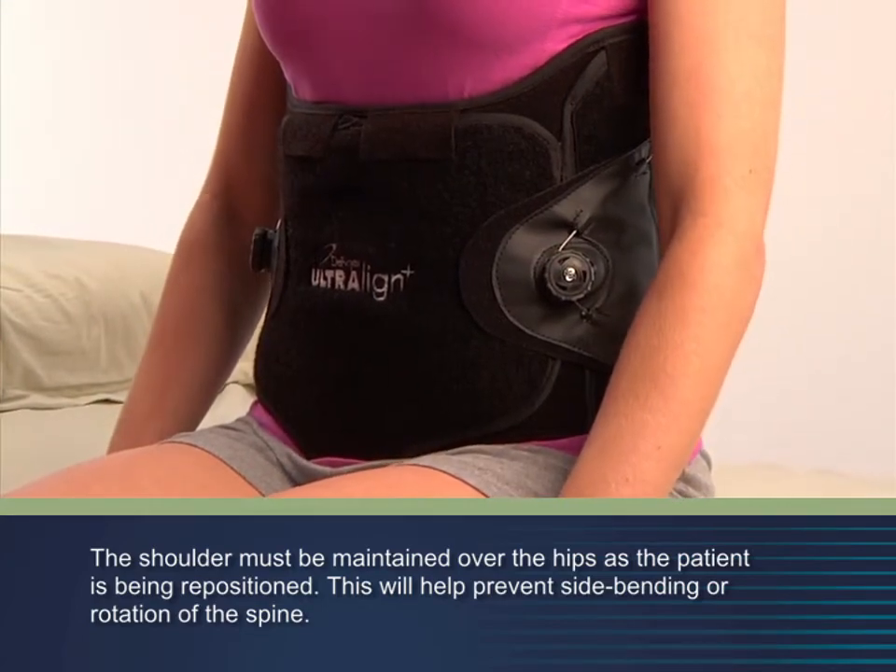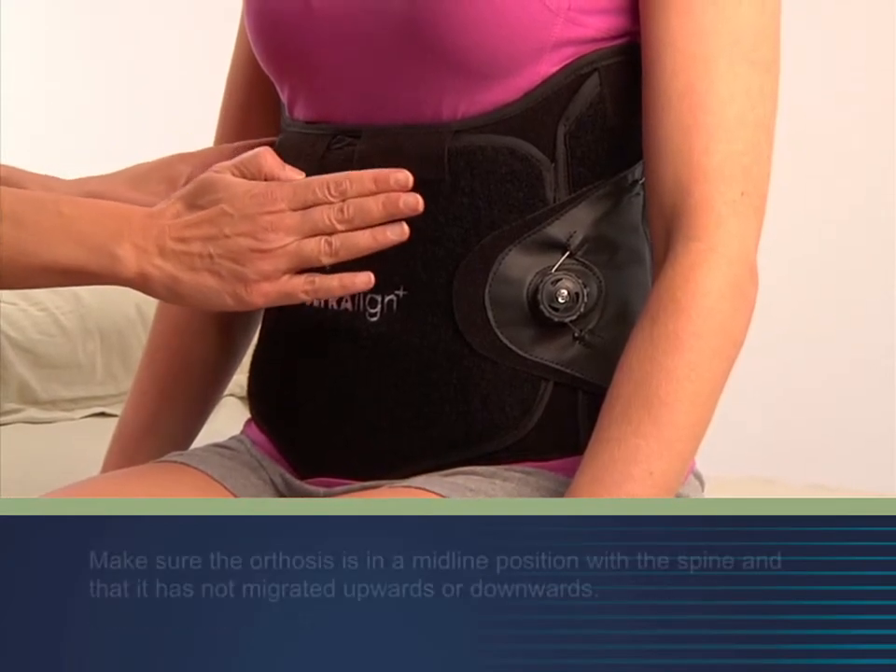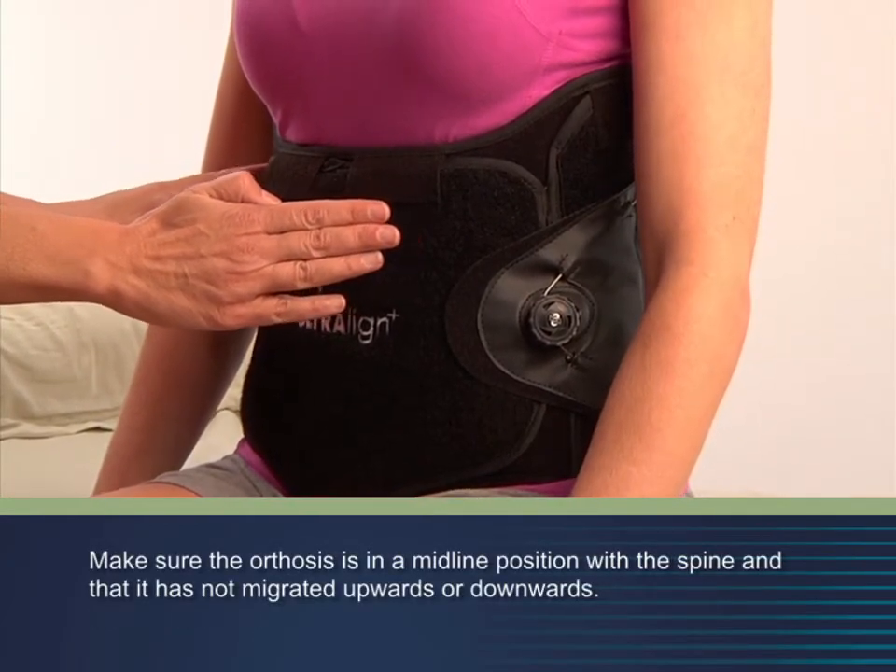Once the patient is positioned, recheck the positioning of the anterior and posterior panels.